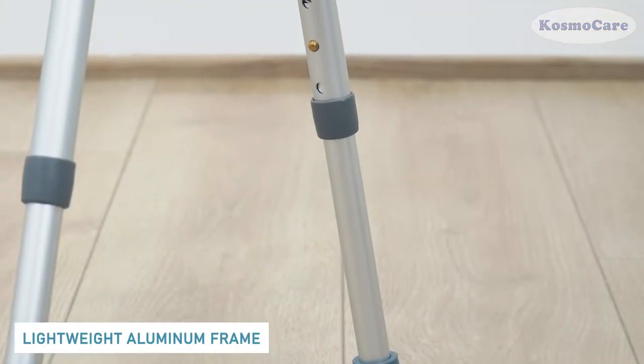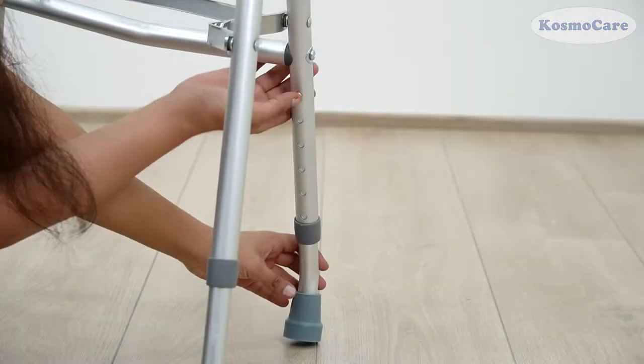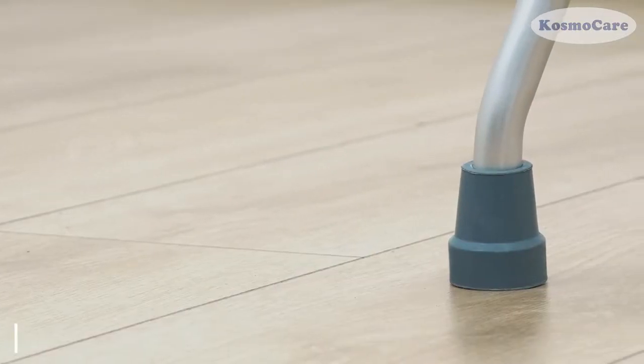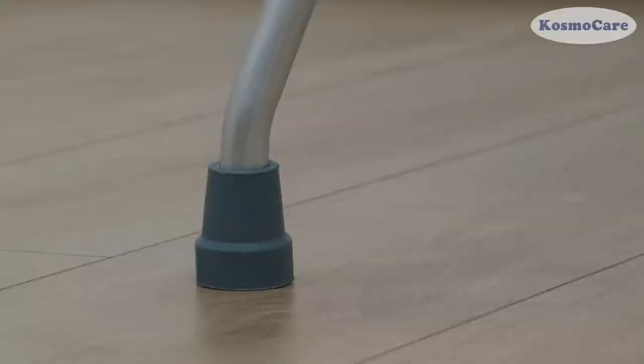The anodized aluminum frame is lightweight yet durable. Adjust the Walker height to provide the perfect customized fit. The Walker is equipped with non-slip rubber pads, providing a safe and secure walk.